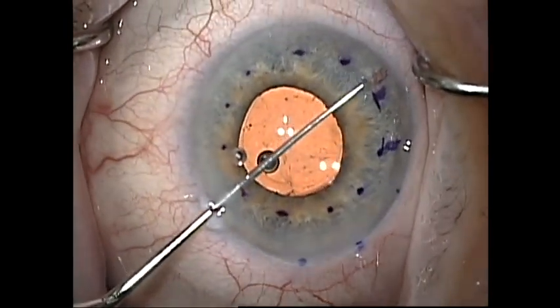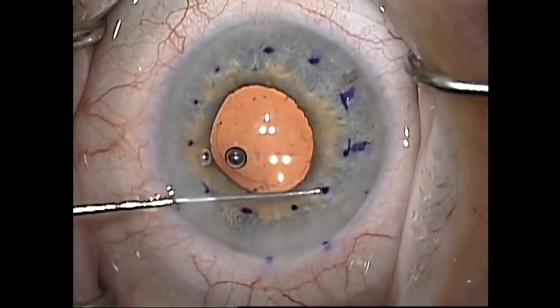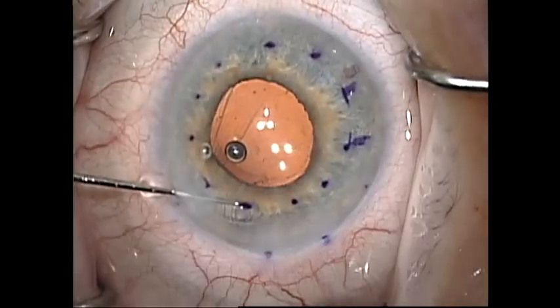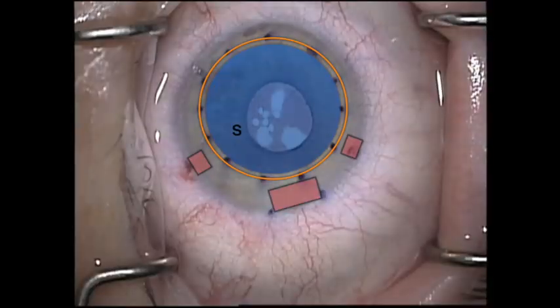I then use a Terry reverse Sinskey hook to gently score along the area of resection. It is very important not to engage the stromal fibrils. It takes a light touch as you do not want any rough areas at all in the bed that you're creating for the DMEC graft. Obtaining a smooth posterior stromal surface and avoiding any overlap of the graft with the Descemet's membrane has been shown to decrease the risk of graft dislocation and graft rebubbles.